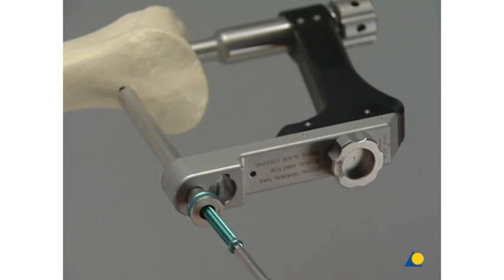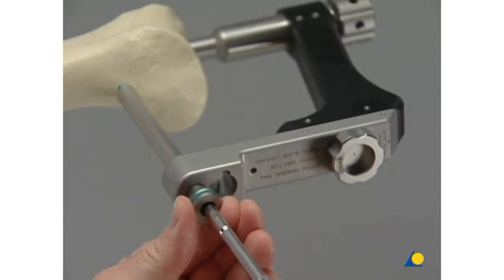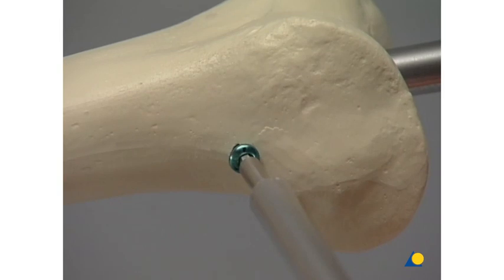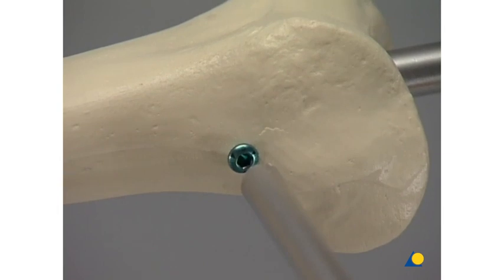The locking screw is inserted through the protection sleeve using the hexagonal screwdriver and screwed into the bone until the head of the screw touches the lateral cortex. Then the protection sleeve is removed.